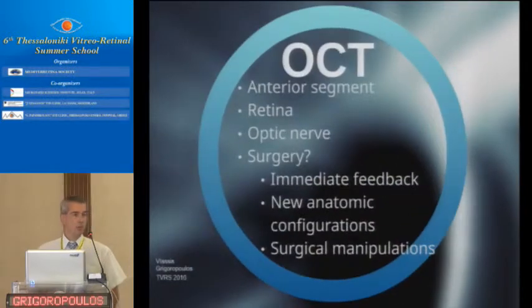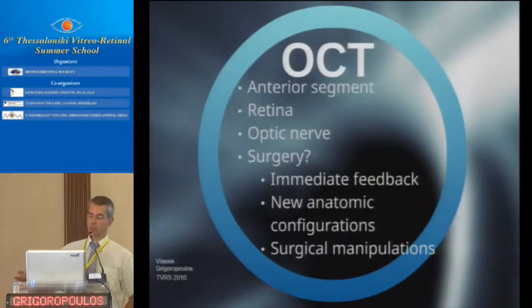And you're all aware also of the OCT. You use it every day in your practice. We use it for the anterior segment. We use it for the retina. We use it for the optic disc. What about surgery? We haven't used it so far for surgery.